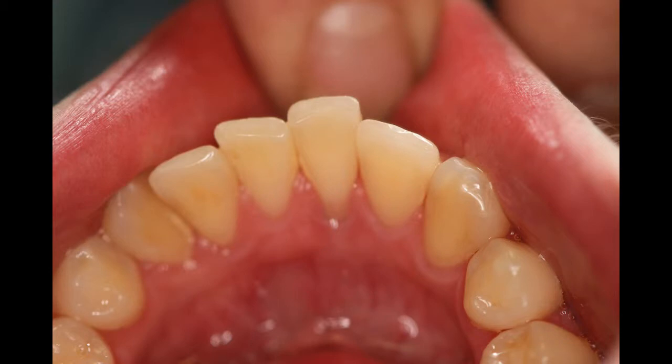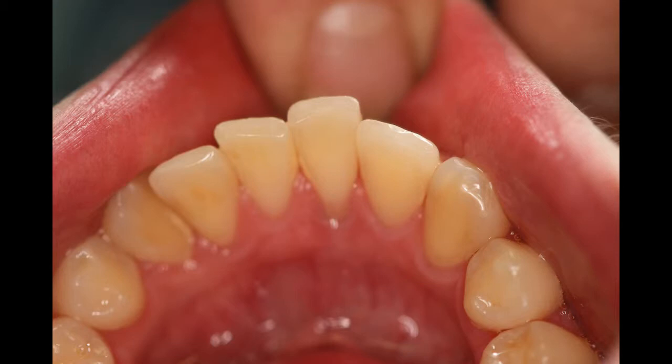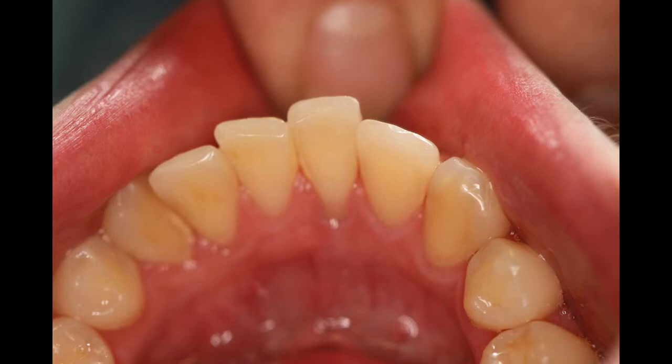A patient can visualize what they walk in the door with, which leads us to the second picture that we take. Once that area is clean, one of the hygienists will re-image that same area. Instead of looking like garbage, it looks pretty nice. So a patient gets to understand what they walked in the door with, and they also get a sense of what it is their hygienist is doing for them. This is an area we can count on looking not so great, and count on looking a whole lot better when they're finished.